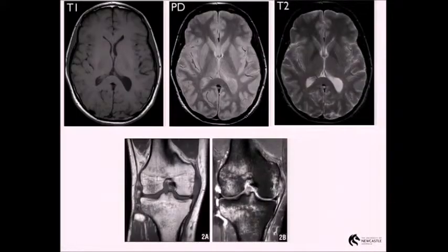If we go back, there's our T1 weighting, so this bright signal around here is subcutaneous fat. We can see a few muscles underlying the scalp, but subcutaneous fat, and here we see our dark water signal associated with CSF.